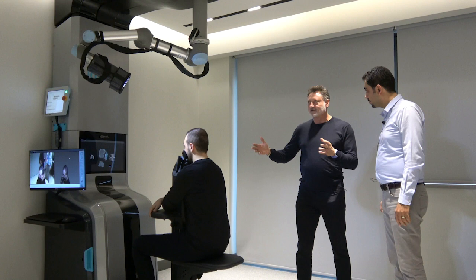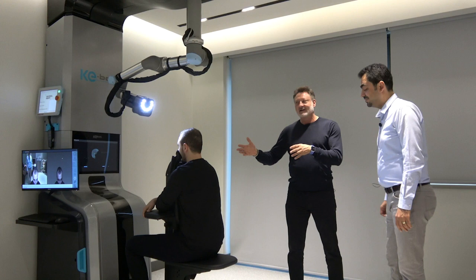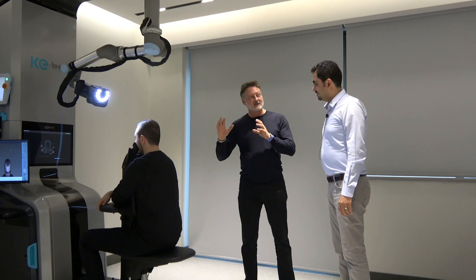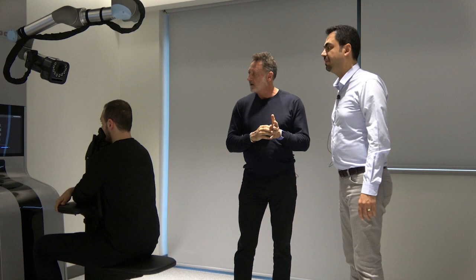Just to clarify, this is not a real patient. If it were a real patient, his head would be shaved. This young man has kindly allowed us to place him in the chair where he has to stay absolutely still. At the pre-op stage it will be roughly five minutes, and at the post-op stage we will have a total of 12 to 14 minutes.